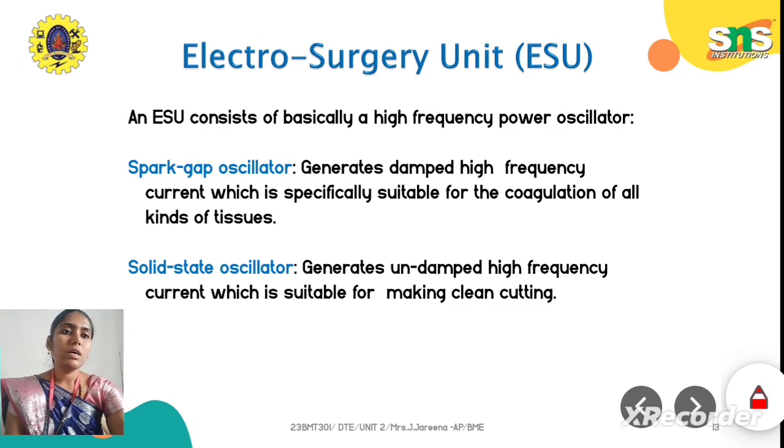Next, we will see the important units in the electrosurgical machine, and the other components involved in the electrosurgical machine, in the next class.